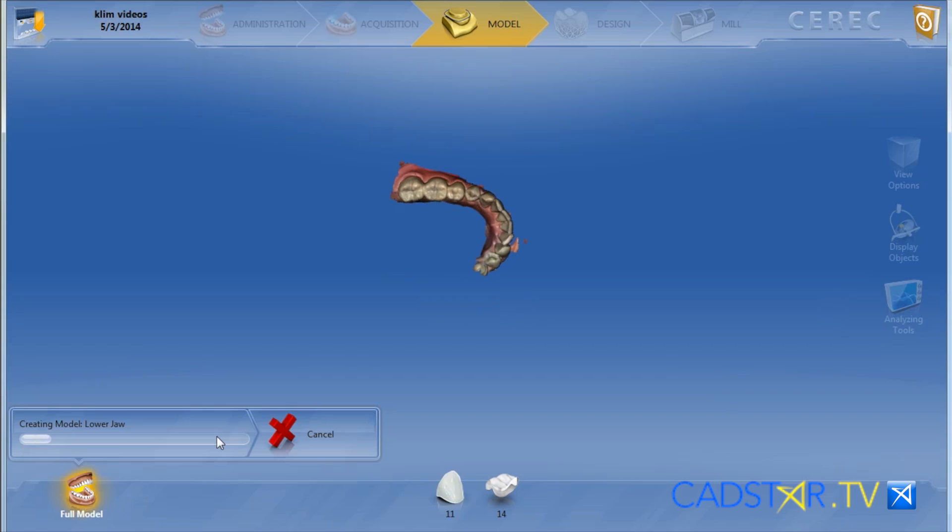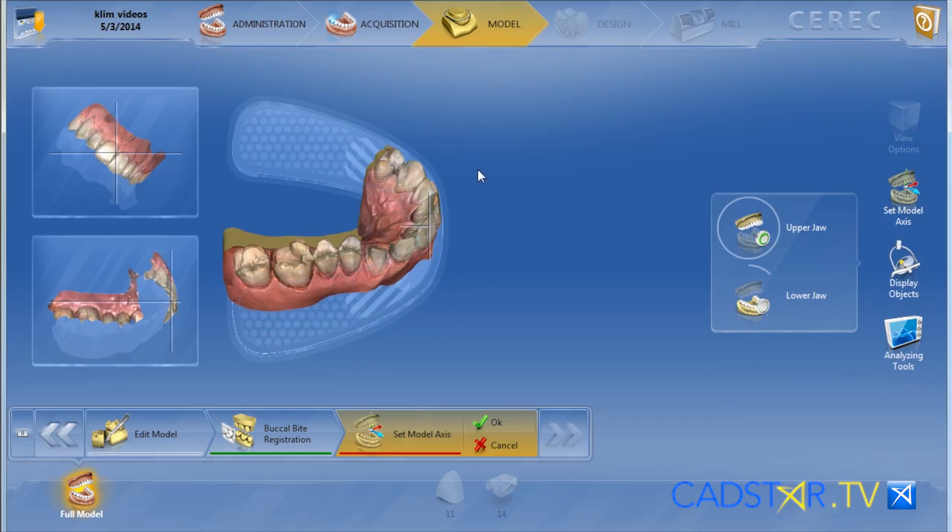Another nice feature: when you're computing from your acquisition screen over to your model screen, you now have a progress bar. You can also activate cancel if you see that computation start to spin — you can cancel and start over, which means you're not going to lose a scan. That's really nice.